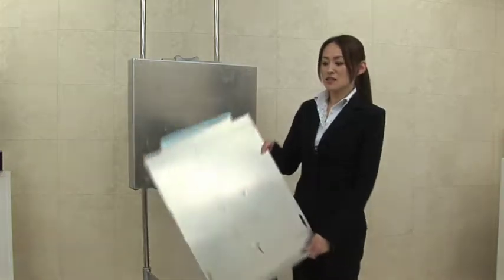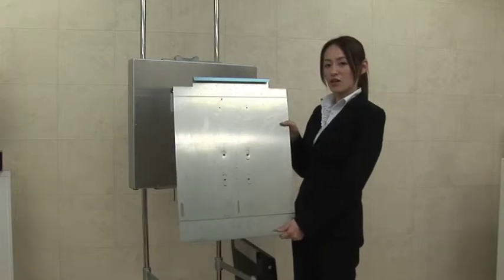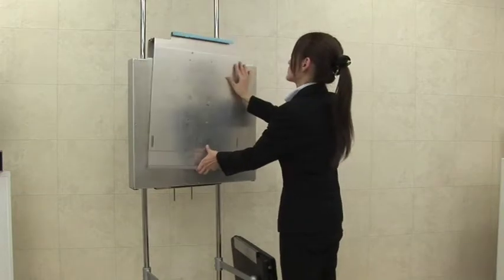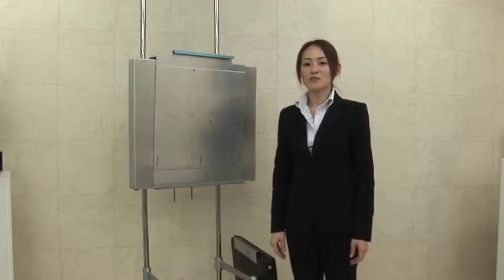To use the Naomi on the existing stand, this is the bracket to hold the Naomi in the upright position. You put this bracket on your X-ray stand, then you place the Naomi on the bracket.